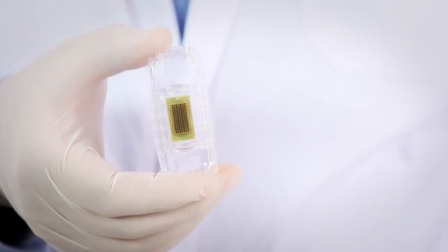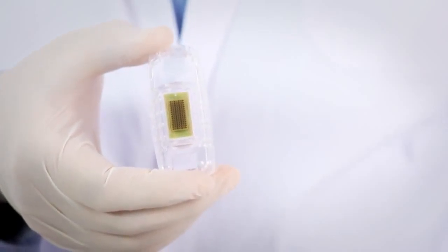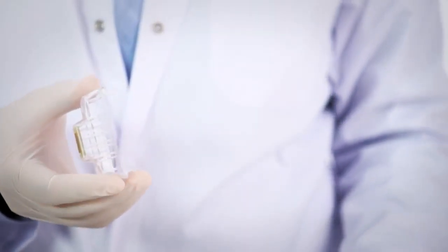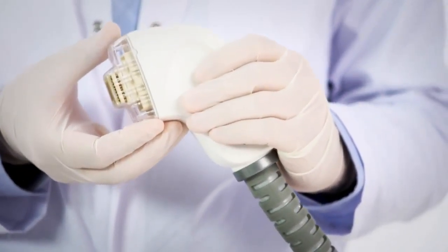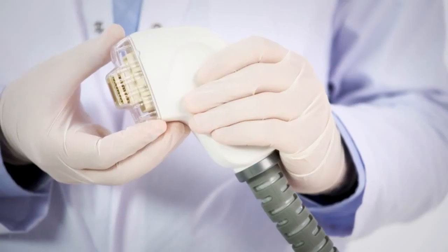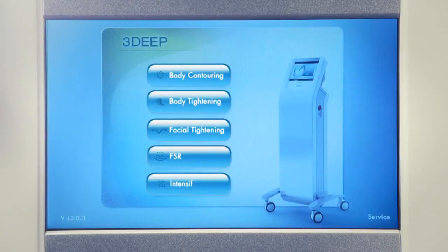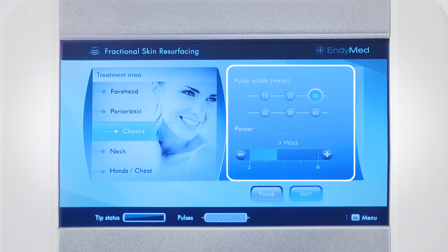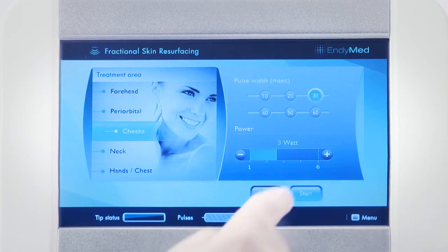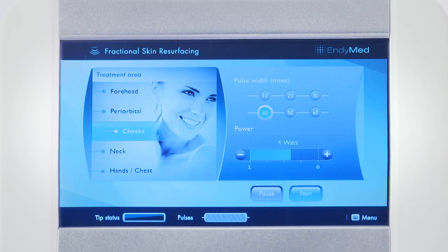The fractional skin resurfacing treatment tip is intended for single use. Hold the FSR tip with 2 fingers from both sides and insert it onto the skin resurfacing handpiece until it clicks into place. When the menu screen opens, select the FSR application. From the treatment menu, select the desired treatment area. We suggest beginning with the cheeks. The system will automatically set the treatment default parameters. You may change the parameters, power and pulse duration, according to your needs.